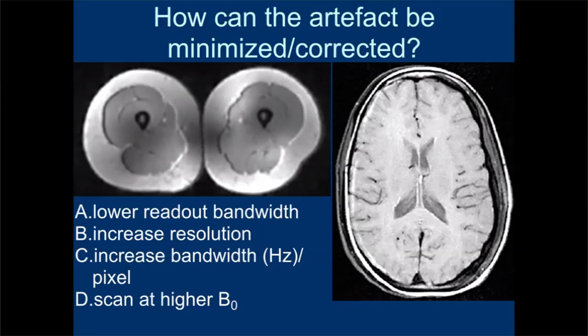All right, so here's a question. How is chemical shift measured? Is it absolute frequency? No. So it scales with B0. Right, it's ppm, so it's always a ratio, depending on the field. So with increased field, actually, this gets worse. I see.